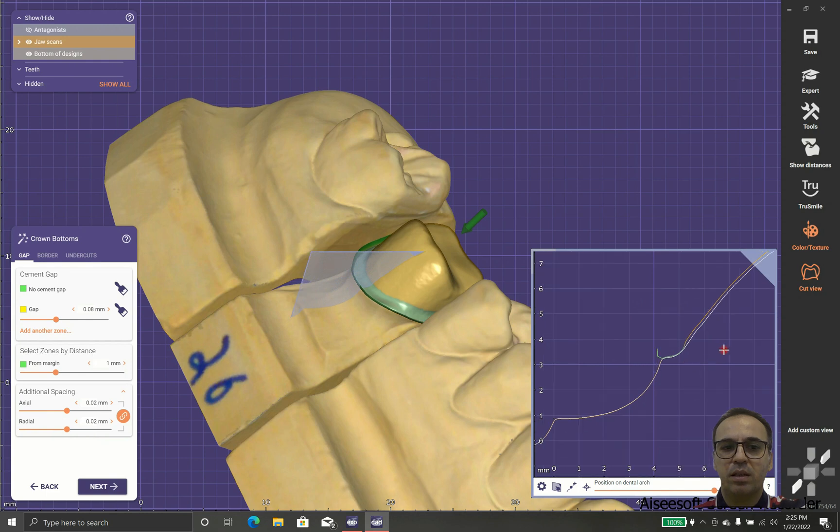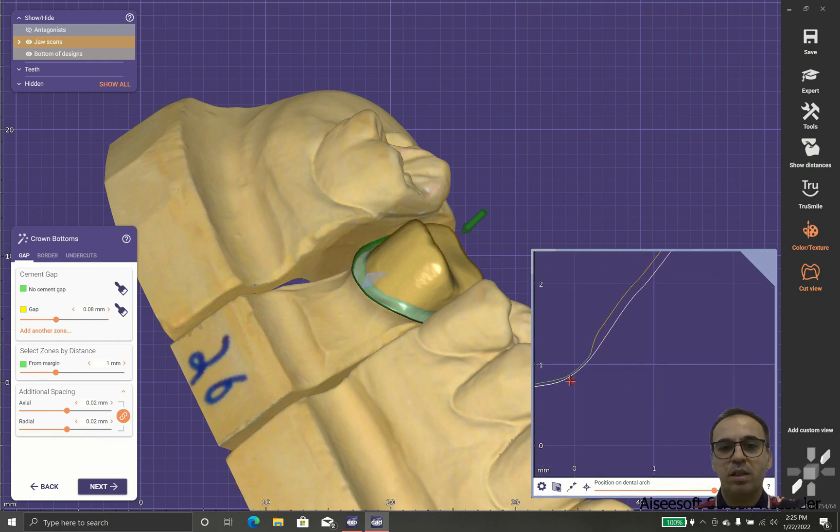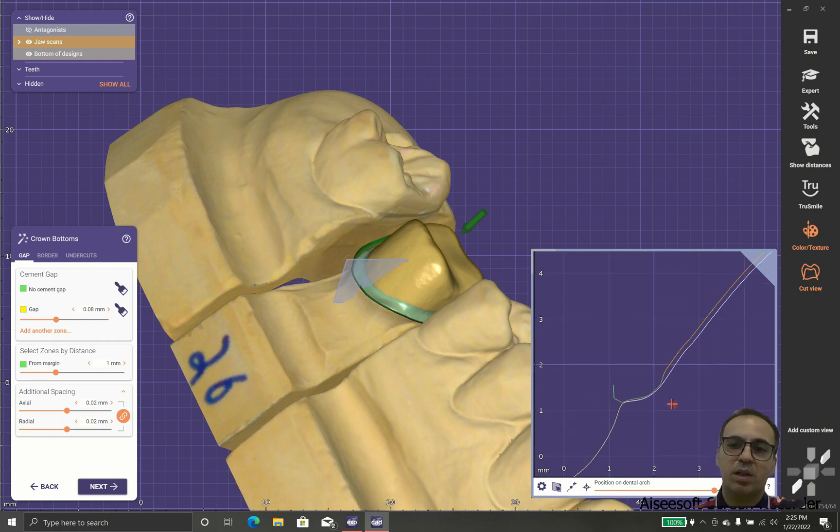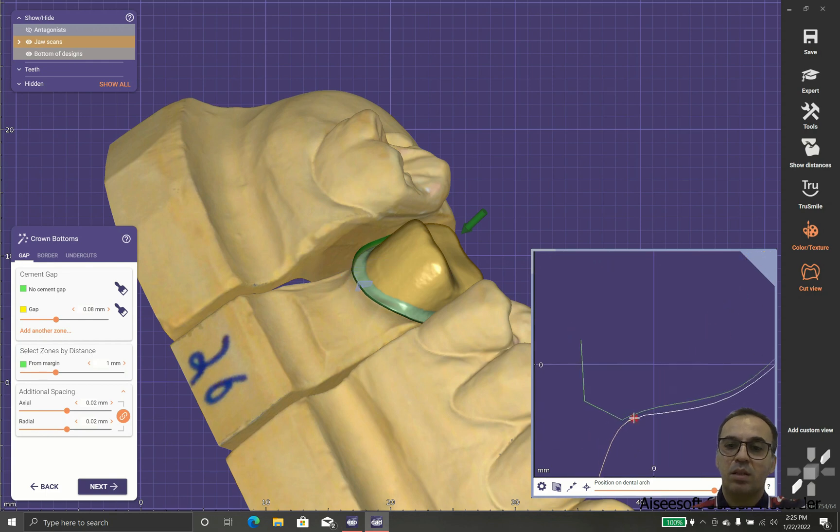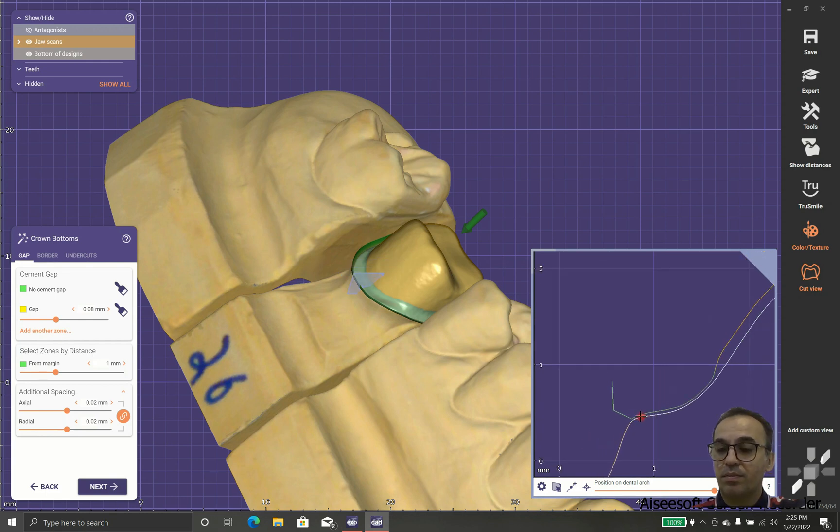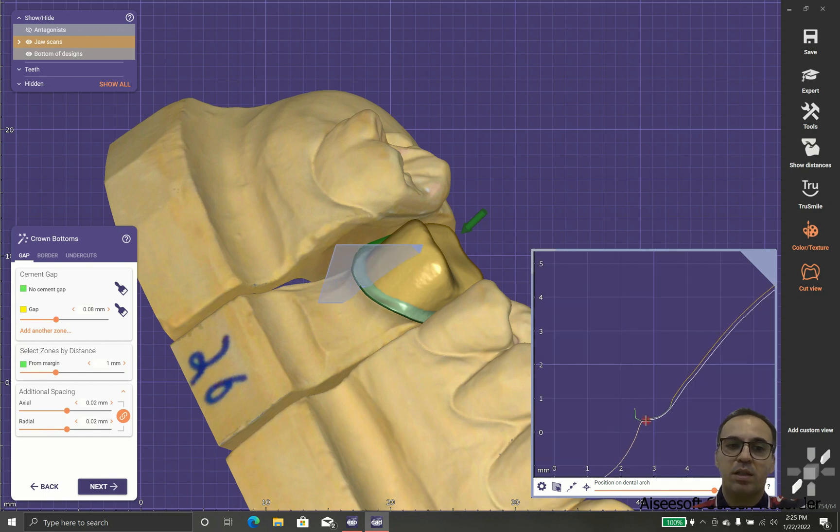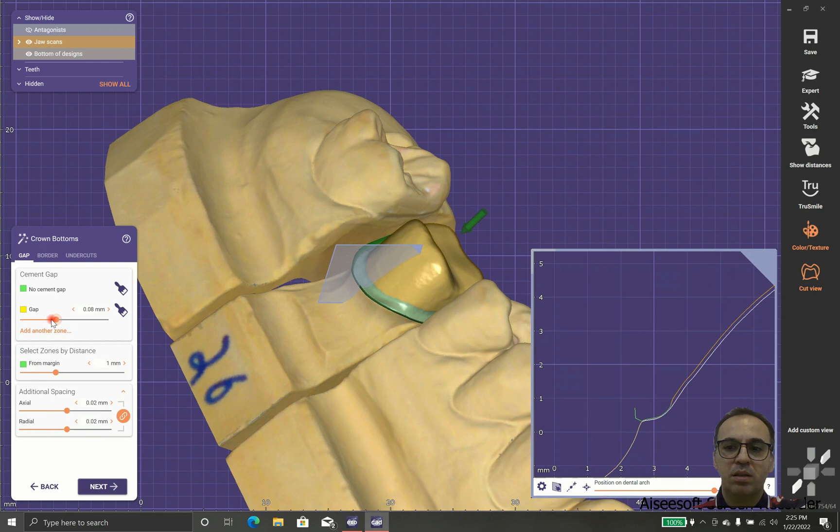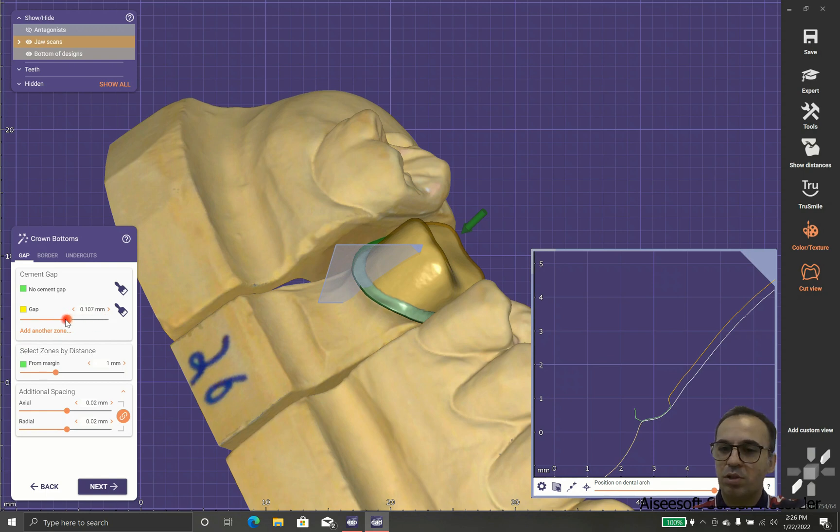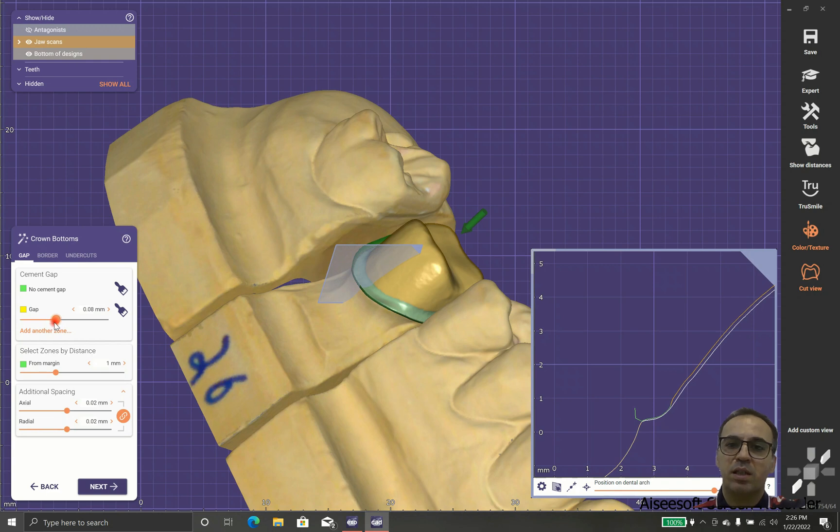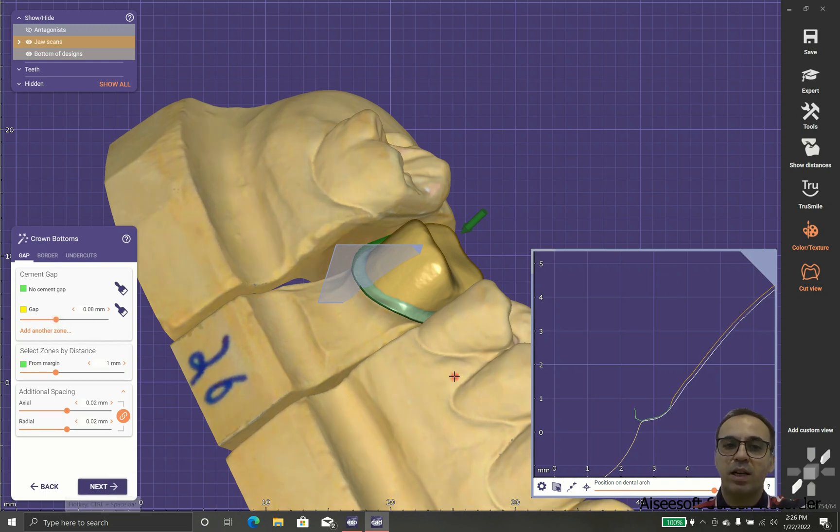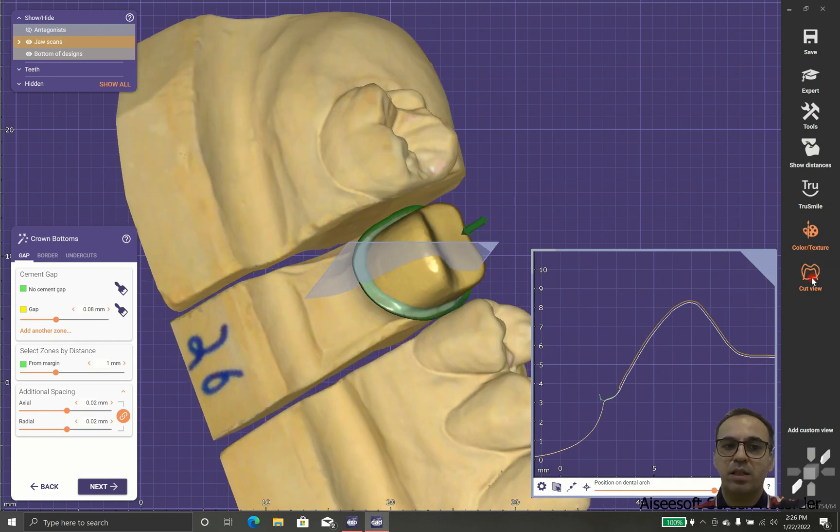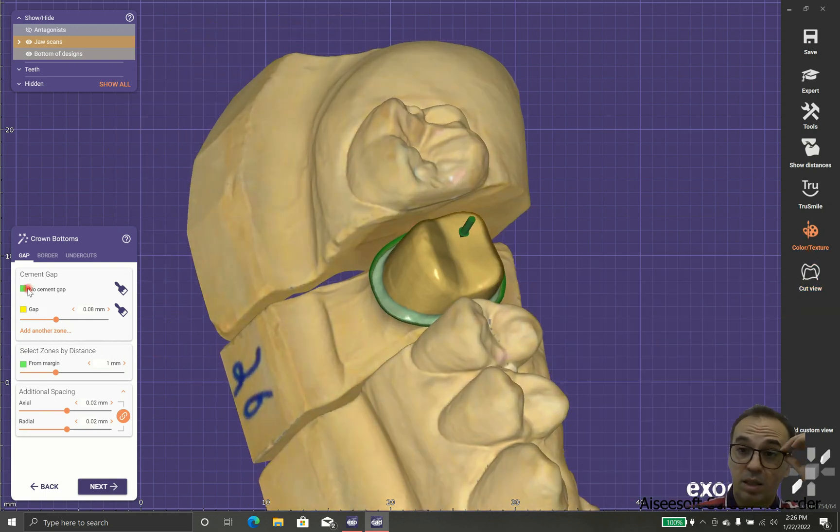It also depends on your milling machine and how accurate and calibrated it is. It's something that you should find with the results. In case that your crowns fit good, it means you do this job properly. In case you have loose crowns, it means we should reduce the gap margin. And in case the crowns don't sit, it means we should increase the gap.